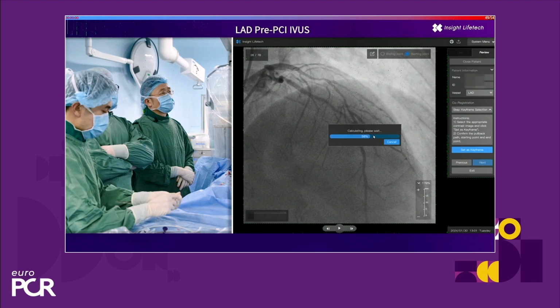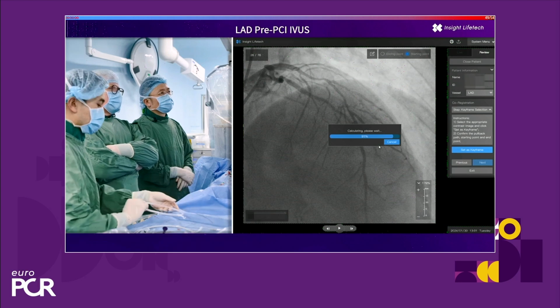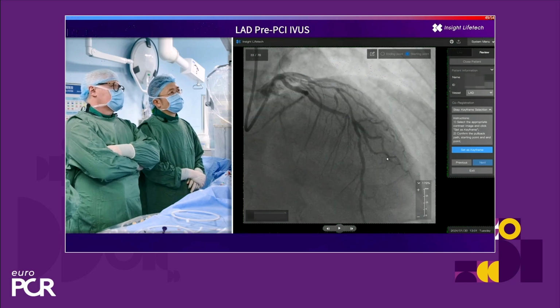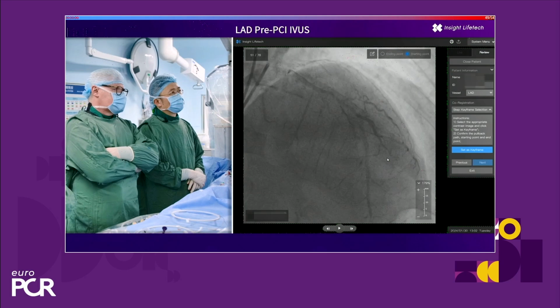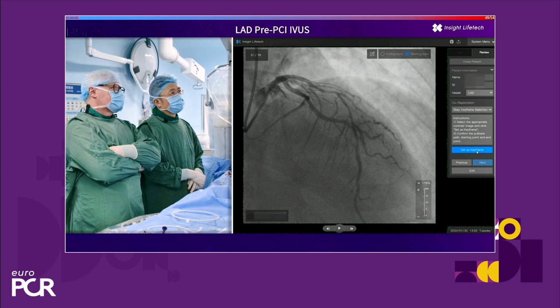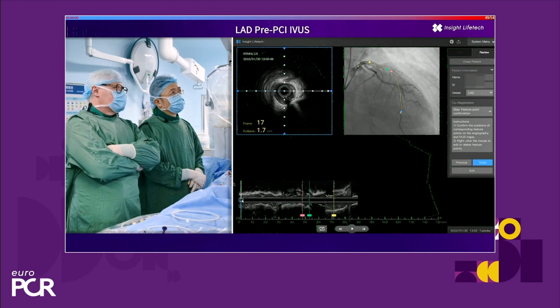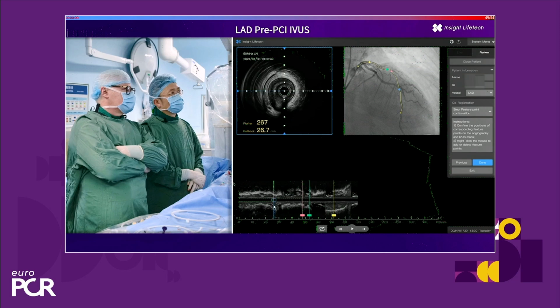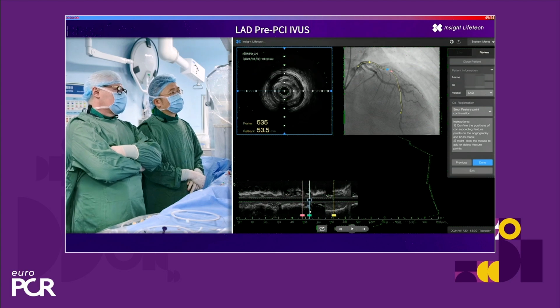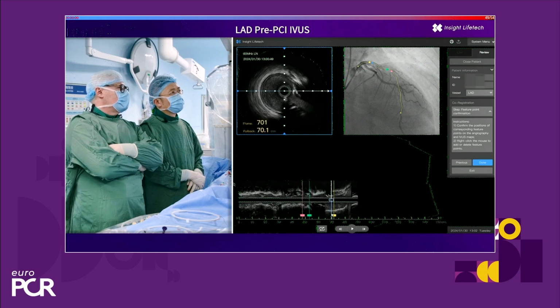There are 2 additional features of this technology which are really good. First, we have online co-registration available, which takes like 1 minute to do, which is not so bad. And at the same time we have automatic quantitative assessment of the vessel, which comes with this device. So now we do co-registration, and this is very easy then to be really sure where we are. You see the blue marker on angiography, which tells us where exactly we are with our probe, and you see the very diffuse disease all along the vessel, up to the proximal part.